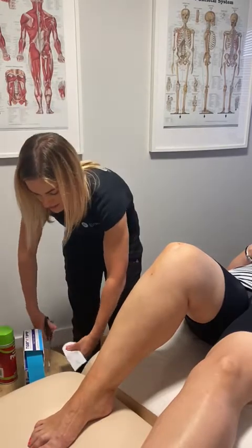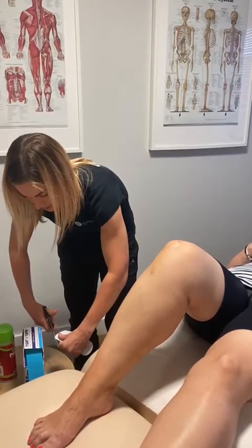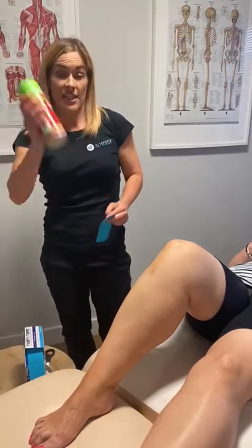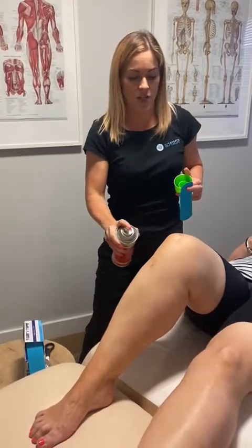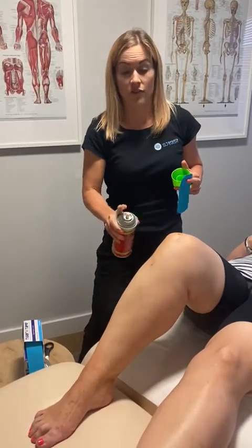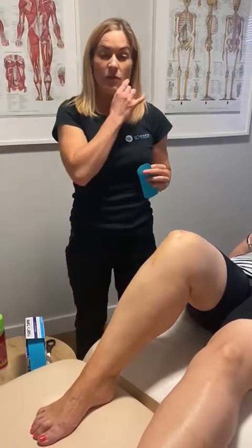okay? And then we are going to prepare the area by, you can use a little bit of adhesive spray if you need to. If you haven't got any, that's absolutely fine. It's worth mentioning that if you have got hairy legs, it's probably better to shave them and do it probably the day before you're going to tape it.